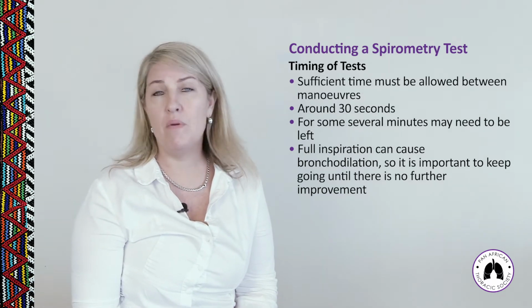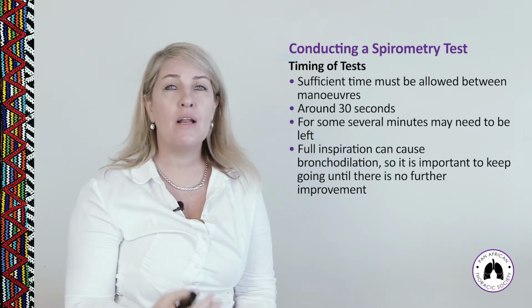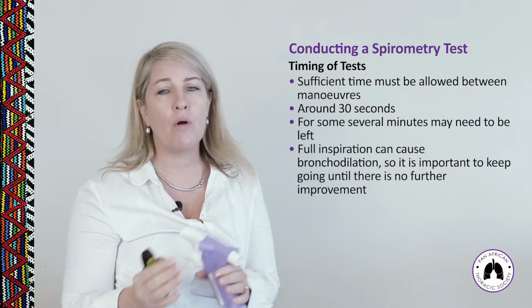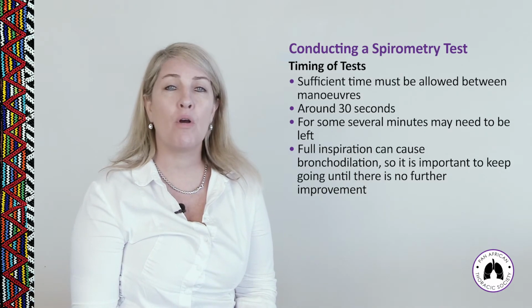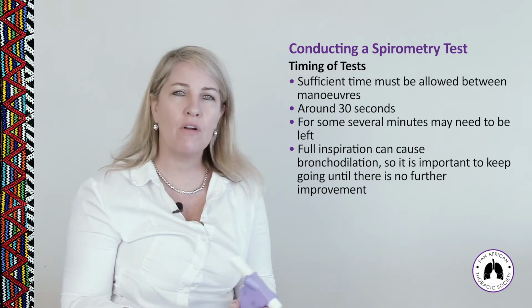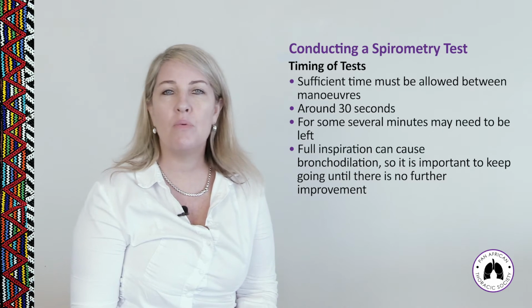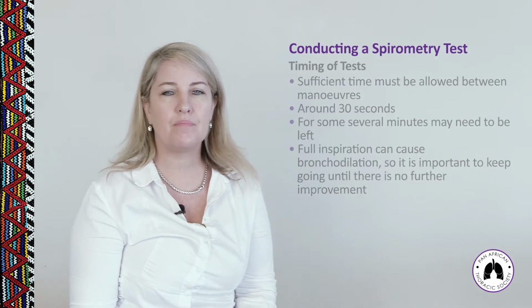So what we know is that full inspiration and constant blowing can cause either bronchoconstriction or bronchodilation. So it's important that if there is blowing-induced bronchodilation, that you keep blowing until the child is fully bronchodilated. And remember, you would then record that on the actual test result itself.